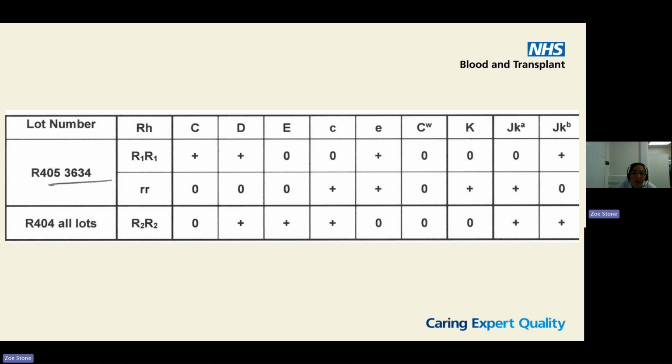And we've also got to be cautious of patients that are big K pos in case they were little k or Cellano negative, because these cells would again absorb that out. So these are considerations that we have if we see a patient who is big K pos, that has any kind of hint of a pan-reactive antibody, even a pan-reactive enzyme. We try and do the little k types.